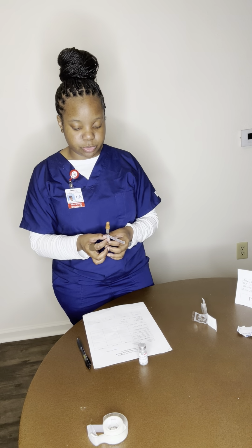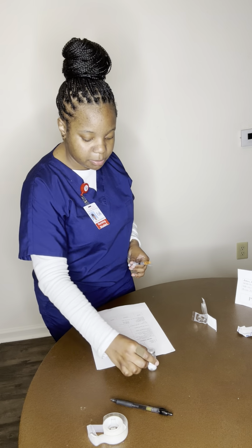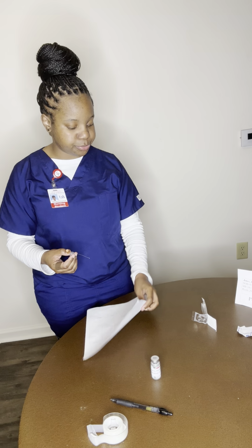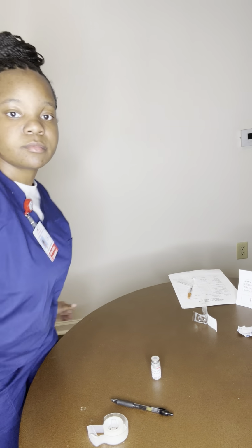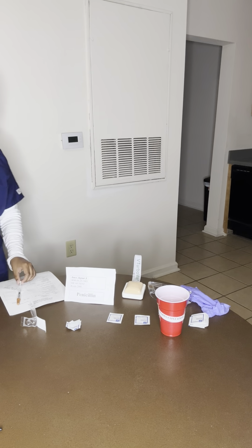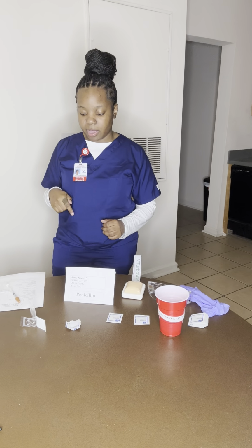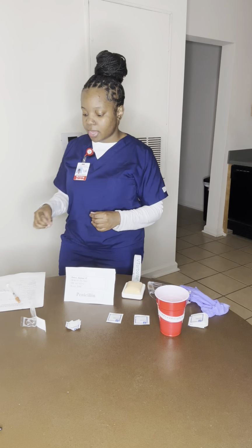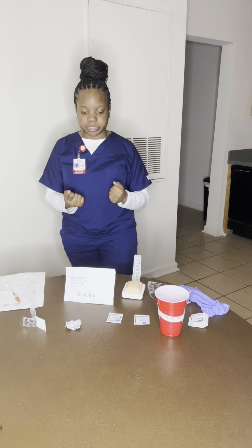And I'm going to take my MAR. I'm going to take my MAR and my syringe, and I'm going to go to my patient's room. This is my patient's room. I have my MAR, so I'm going to knock on the door. Hi, Mr. Jaguar Jones. I am here to give you a shot of heparin. I'm going to perform hand hygiene, and I will go over to the patient.